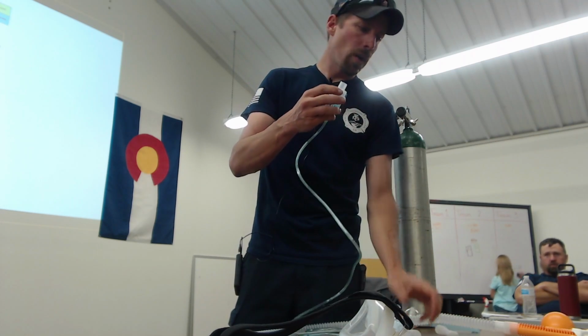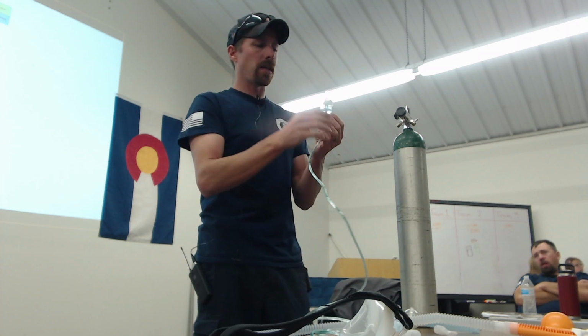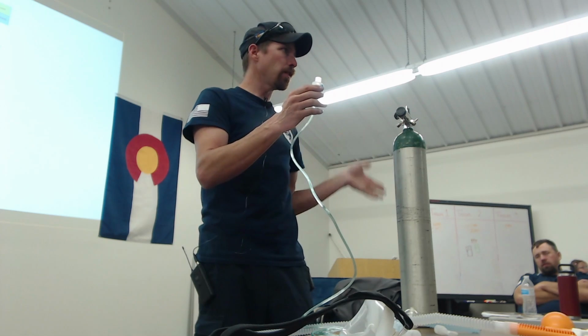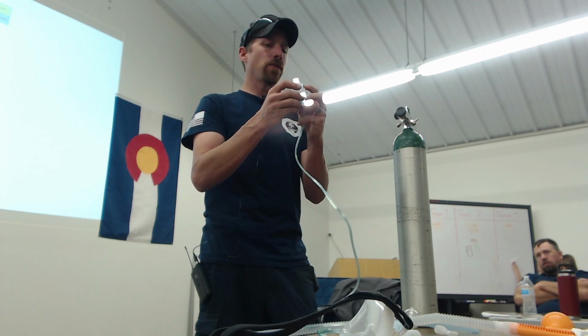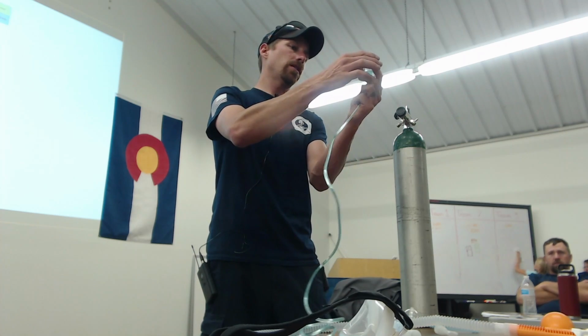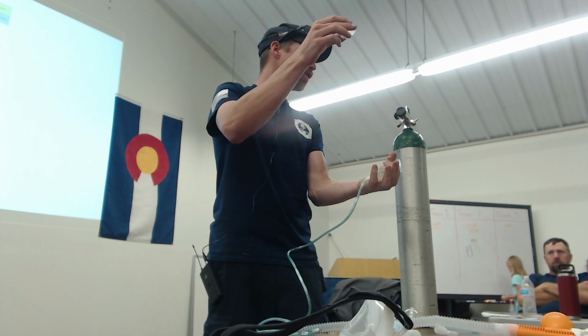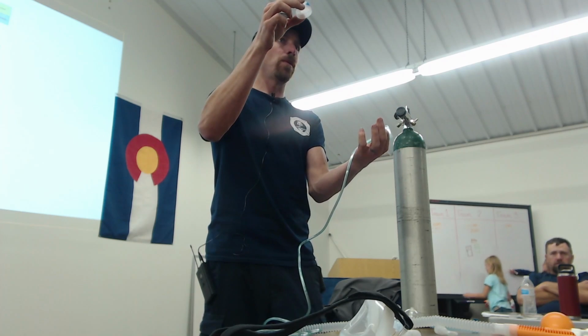So one thing you're going to want to make sure of, the nebulizer that comes with the kit is a little bit special. It's got this blue port on the side, which is a little different than our regular nebulizers. They don't have that blue port. The reason for that blue port is so that once we're all hooked up and everything's under pressure, if you need to add more medication, if you unscrew this while this whole system is under pressure, you're going to start losing all your pressure out the bottom of the nebulizer.